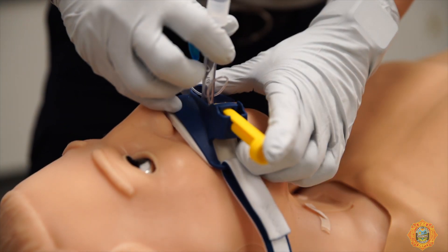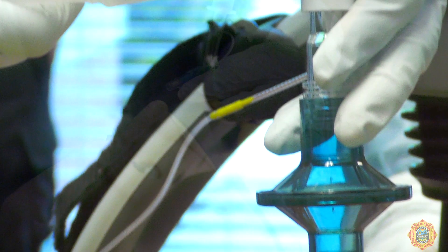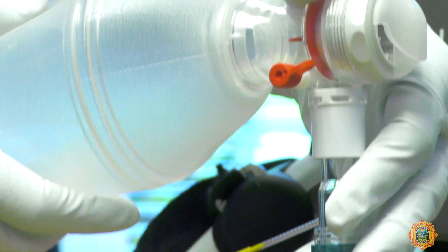Secure the ET tube with a commercially available tube securing device. Confirm proper placement of the ET tube and attach end-tidal CO2 filter line. As EMS providers, confirming airway patency and adequate oxygenation is paramount after ensuring scene safety. A patent airway is crucial and the process of ventilation and oxygenation is necessary to sustain life. Airway management is at the top of our list of life-threatening concerns to achieve prior to moving on to another intervention. Remember that when there is no airway, there is no patient. Always ready, proud to serve.